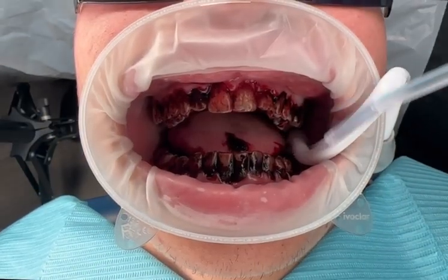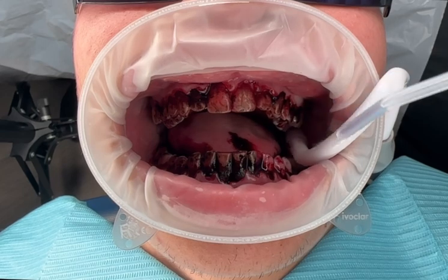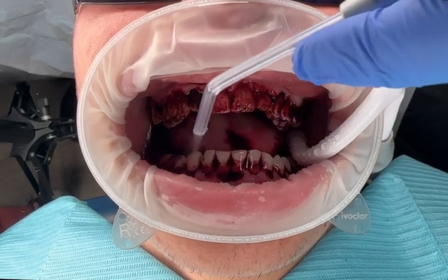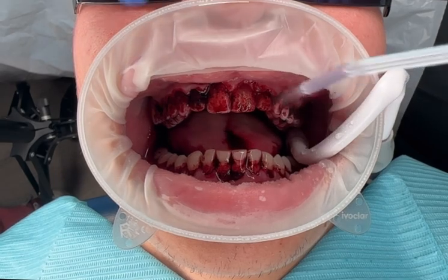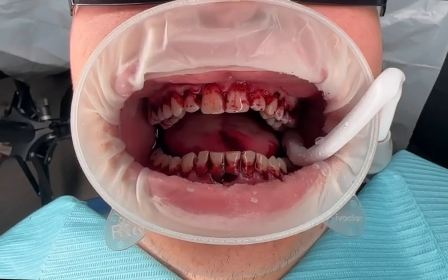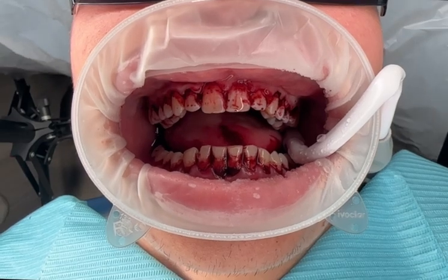Stage 2. After approximately 30 seconds, the excess dye is washed away to expose the stained plaque. Pay close attention to how the majority of calculus is localized closer to the gingival margins, highlighting where brushing must be improved.